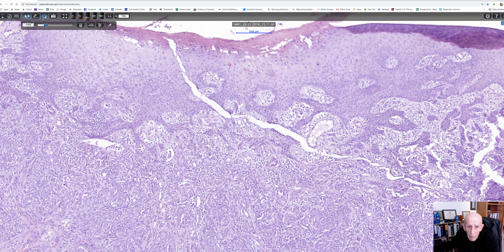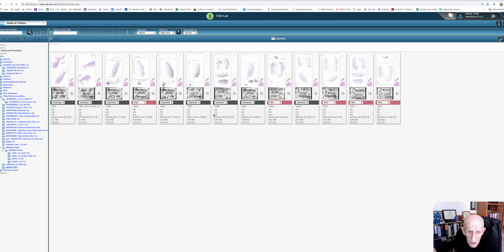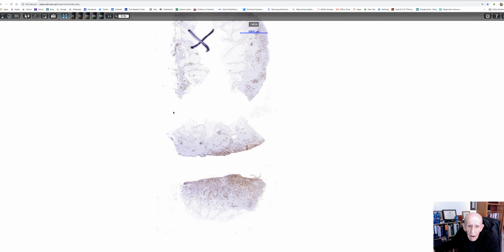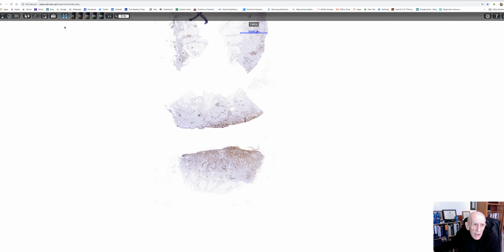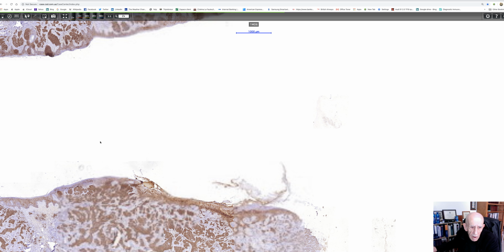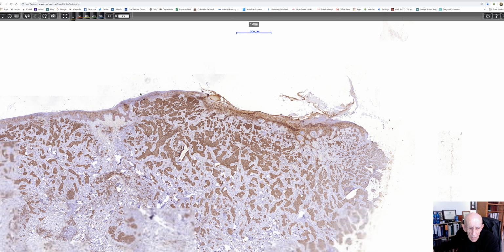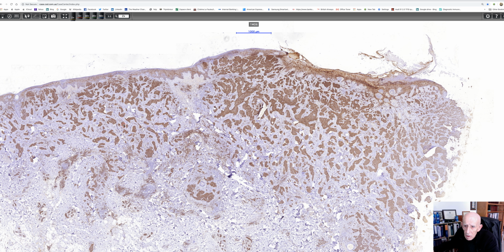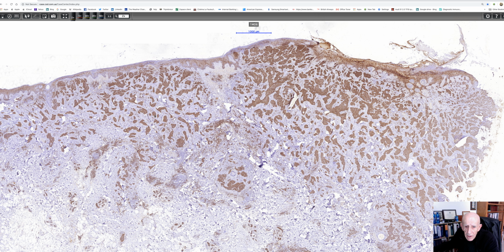Now, I think we've got some immunohistochemistry, which, to be honest with you, I don't think we need. I don't think you get anything out of it in this tumor. But we'll look at EMA and CEA. I don't know what else Antonina did. She probably did all sorts of things, but one of the things I've learned, and I'm pretty consistent about, is this: if you look at an appendage tumor and you don't know what it is on the H&E, then I have little faith that I'm going to advance myself too much with immunohistochemistry.